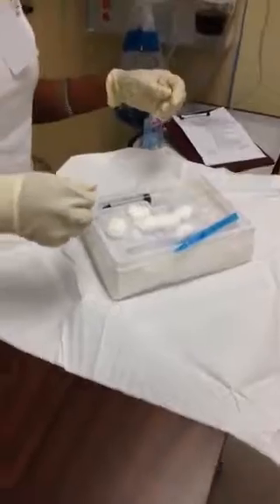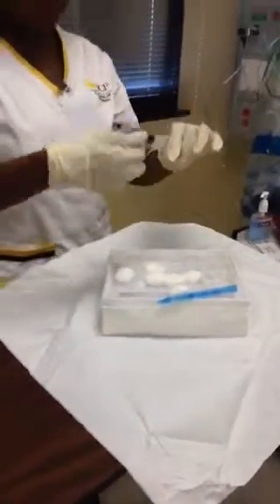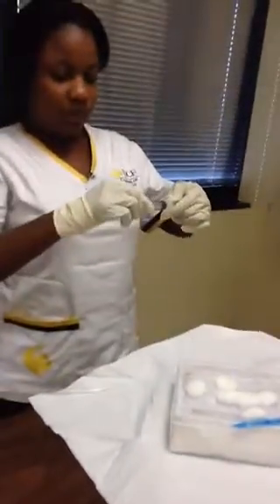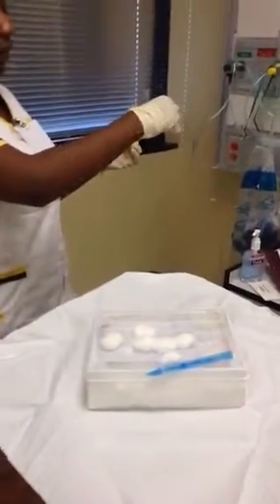Okay, next thing I'm going to do, I'm going to remove the tip of the syringe. Remove the tip, not the plunger. Exercise my plunger. Trash it.